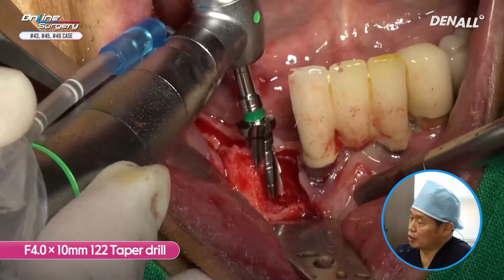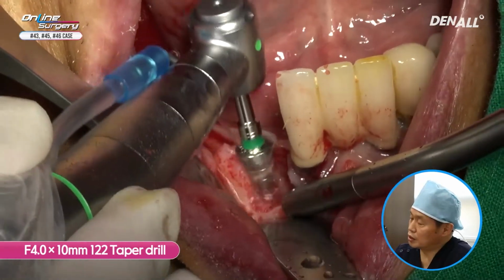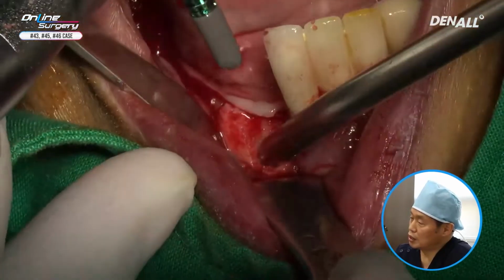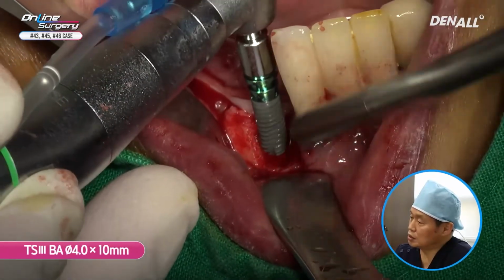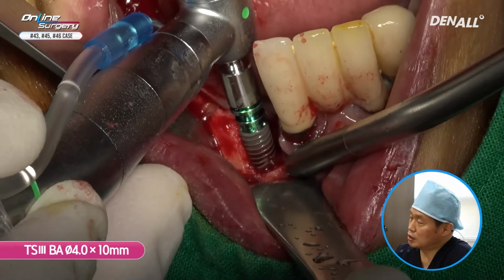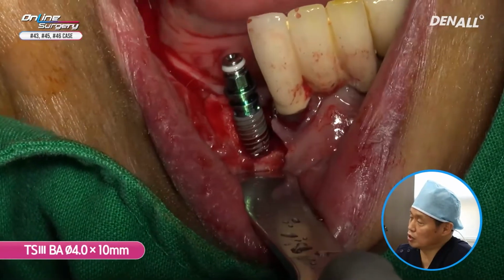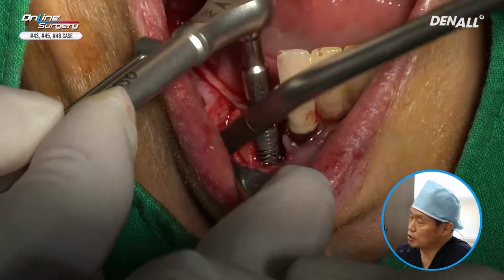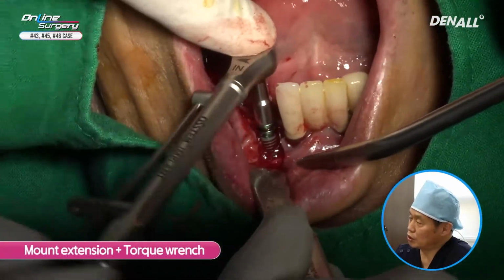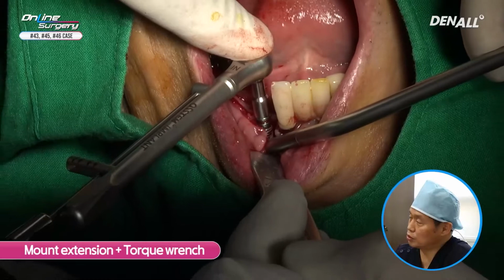As you can see on the labial side, there's a bone defect. Following the cortical bone height on the lingual side, a TSIII BA 4.0 by 10 mm implant is placed. In the case of a hydrophilic implant, irrigate ahead before placement. Using a hand wrench, I'm trying to find the final position.